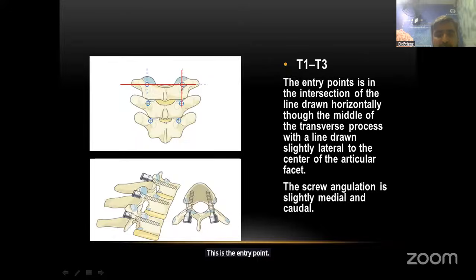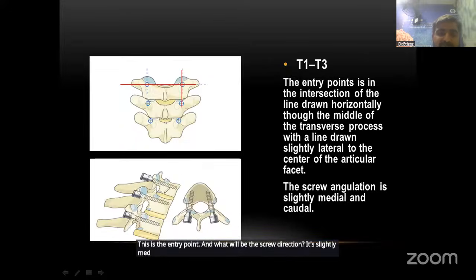And what will be the screw direction? It's slightly medial and caudally placed. Look here, this one. This is the lateral view. This is slightly medial and in the caudal direction.